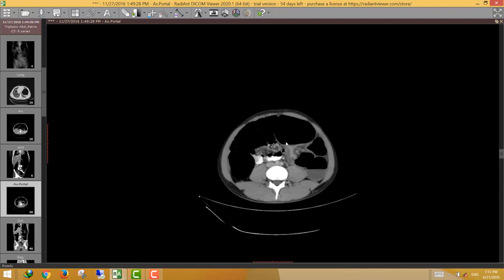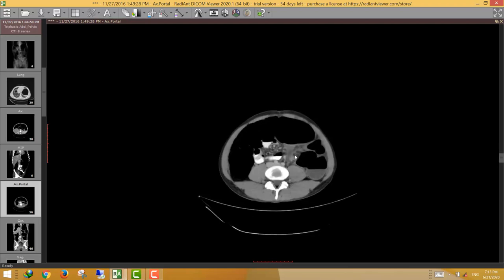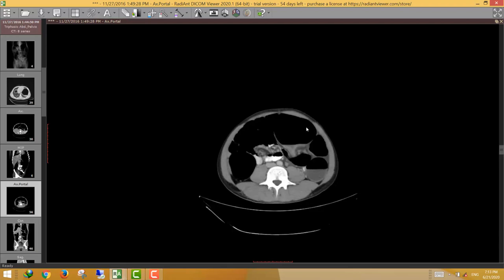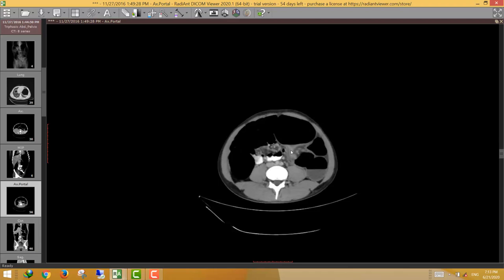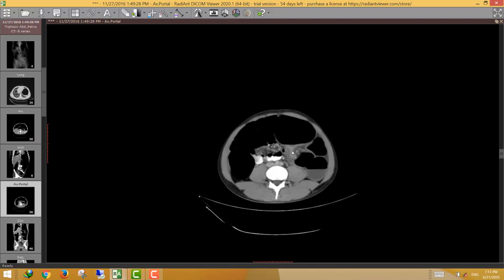At the transitional zone, look for the cause of obstruction — a mass or mural thickening. In this case there is no definite obstructing lesion, but there is an abrupt caliber change at the site of obstruction.